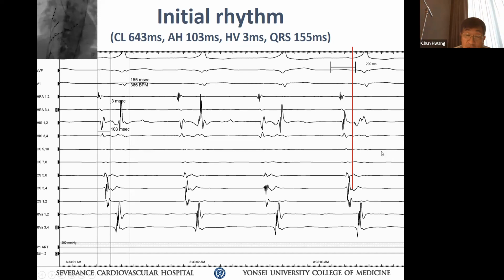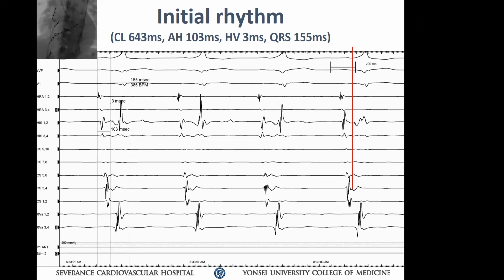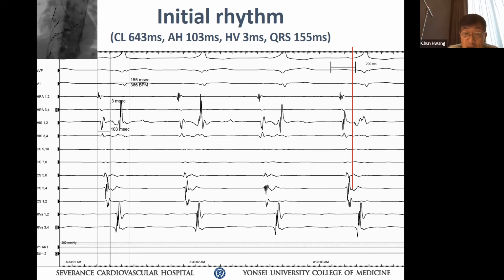So the explanation could be that the catheter is unstable, or it could be because of your vector of activation of the septum coming from the delta wave, a left lateral pathway colliding at the septum, invasion of two different wavefronts. That's why your EGM changes so much. Make sense what I'm telling you? Right? Any question about this? So if you ask me where the pathway is going to be, I would say probably more mitral annulus. That's what I told you.